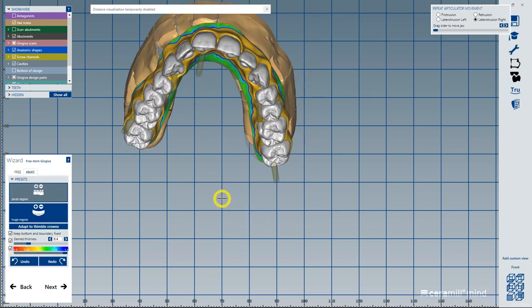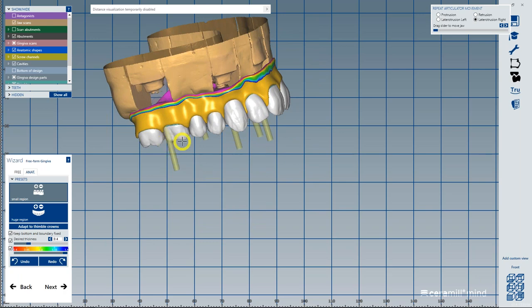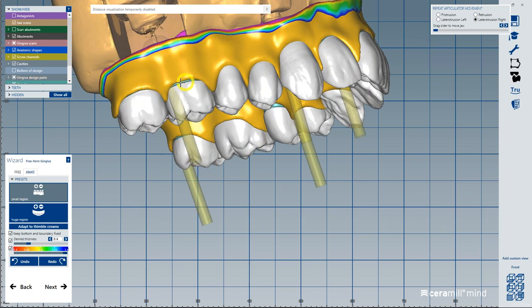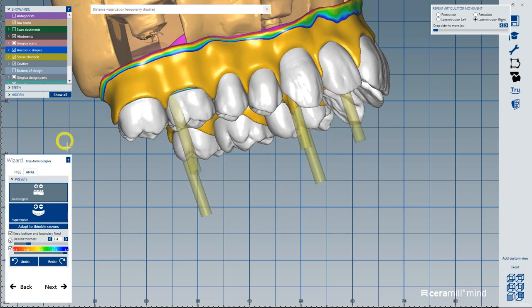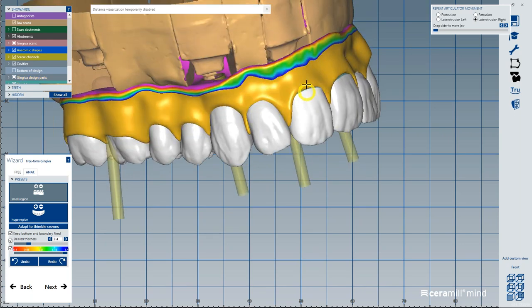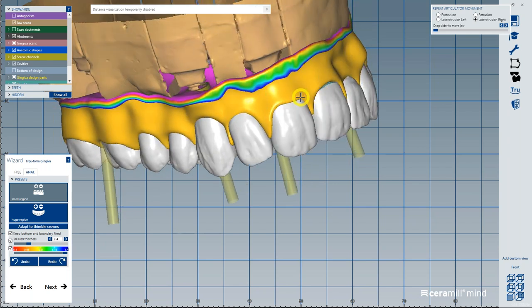So it gives me freeform gingiva again. The reason why is for a couple locations, and I'm glad we had a few. See this area right here? That's where we want to adjust and bring that up. So I can grab this. I just want to hide that. Anywhere you see that, it's where the gingiva is a little short. It's like hiding the margin on an abutment. It's the same thing. We want that gingival material to cover that margin.